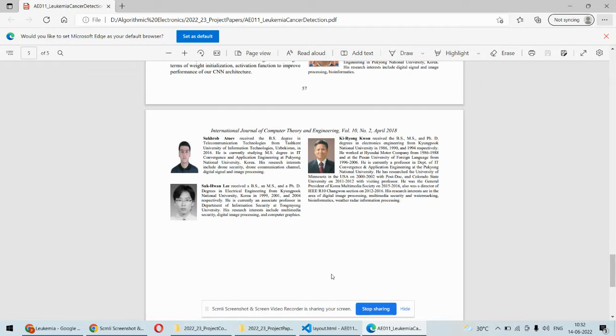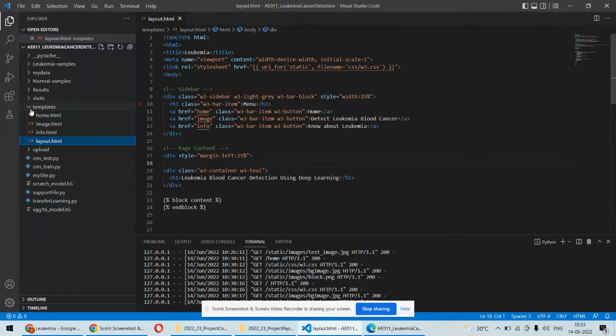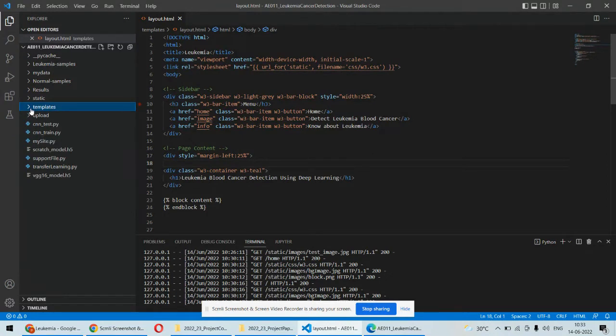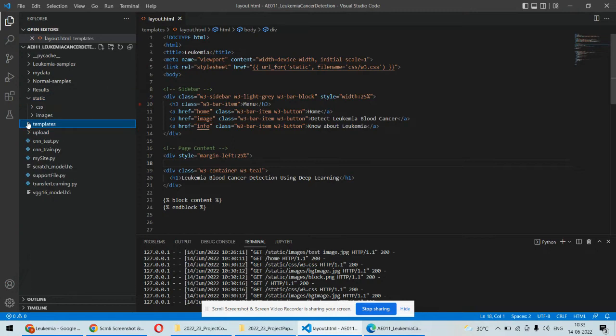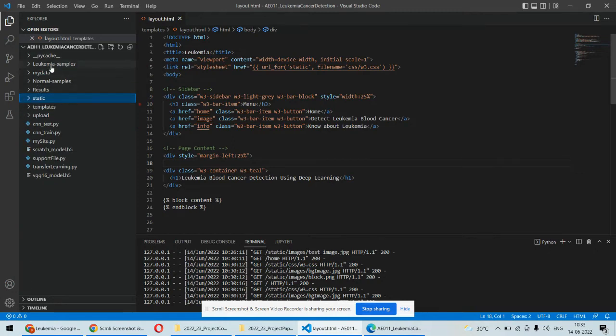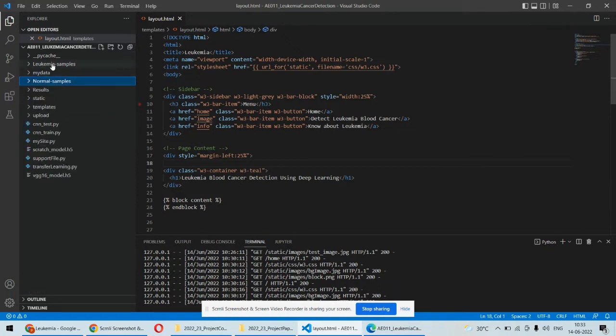Coming back to the implementation part, we have these files and folders. In the templates folder, some CSS and HTML documents are there, and we have some datasets as well. The normal samples have normal blood cells, and the leukemia blood samples are different.